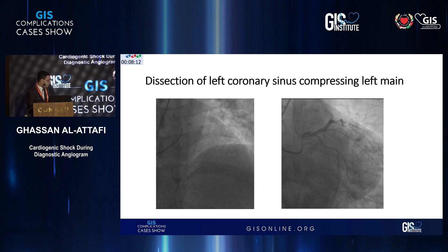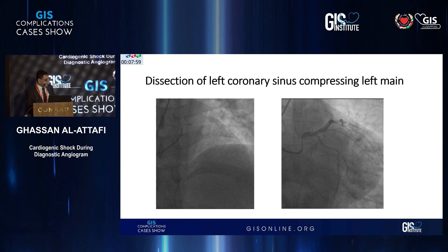Assuming the patient is hemodynamically stable and the catheter is out — it's difficult to judge clearly, but there is dye hold on the picture on the left and it looks like a dissection in the left main. Without the moving images it's hard to be certain, but yes, it looks like a left main dissection. You probably wouldn't leave it.